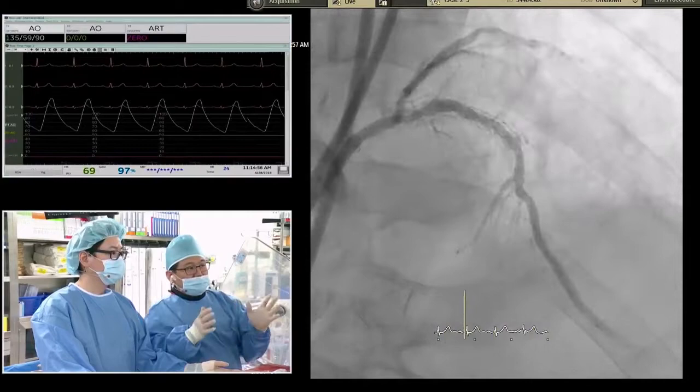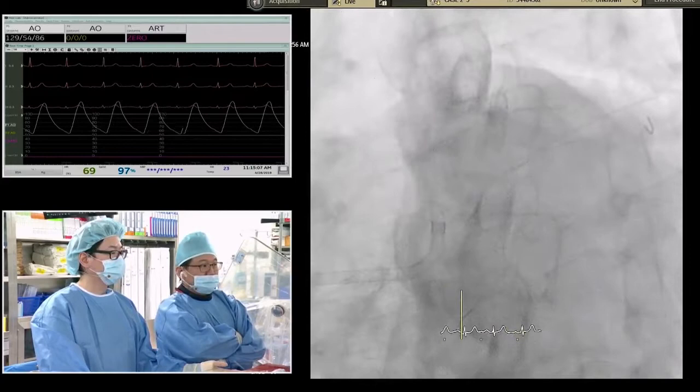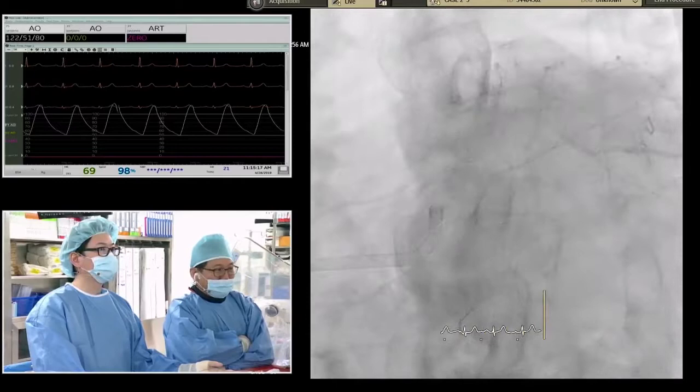So do you have a spider view? Could you show the spider view? Okay, run please. Yeah, not easy. Do you have a comment? And did you FFR the circumflex? No, impossible. Wire insertion itself is not easy. I would bet that the stent struts may be involving the circumflex ostium, Greg.